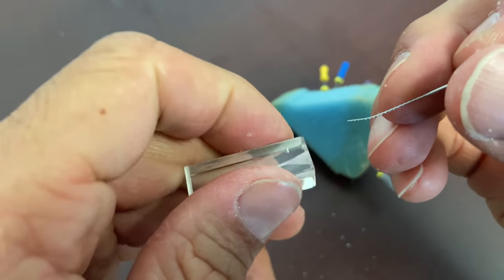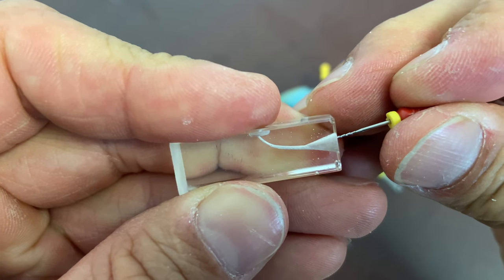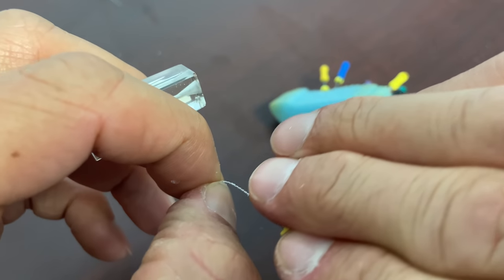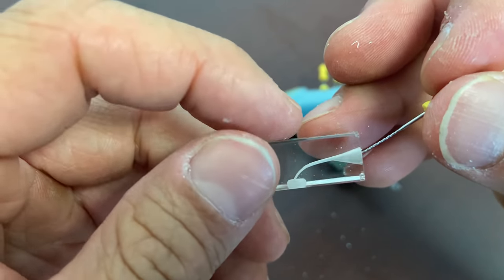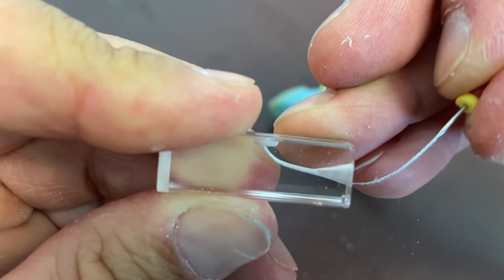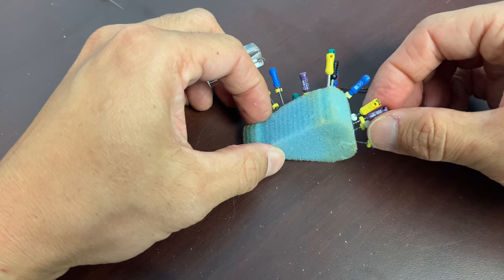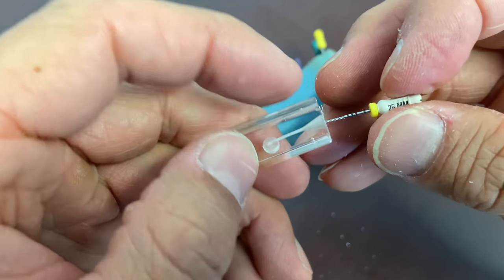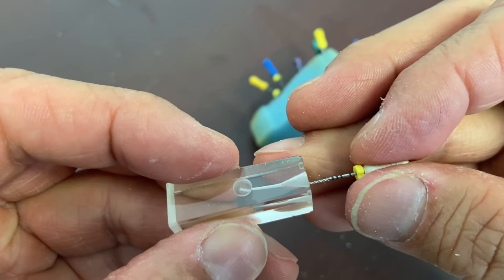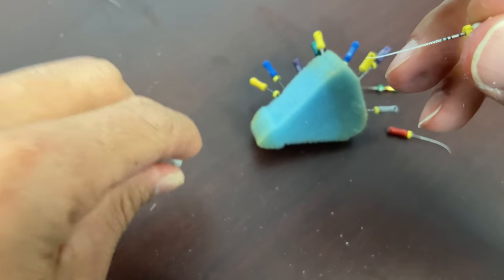What Hedstrom files are good for is placing around a curve to file ledges. An assorted pack of these is really useful if you're doing more root canals. You can sneak the file past a ledge spot, pull, and it'll get rid of that little ledge. Regular K-files work too, but Hedstroms are much more efficient for smoothing that out. Check patency afterward — there was a little blockage from debris, but we're good.